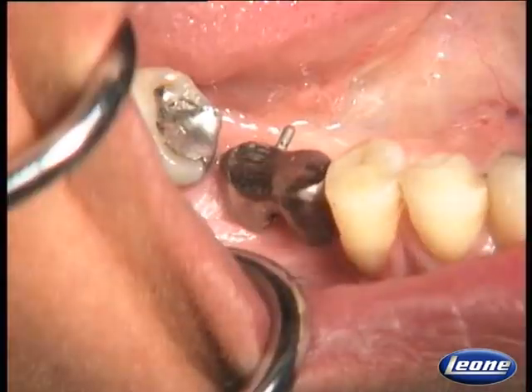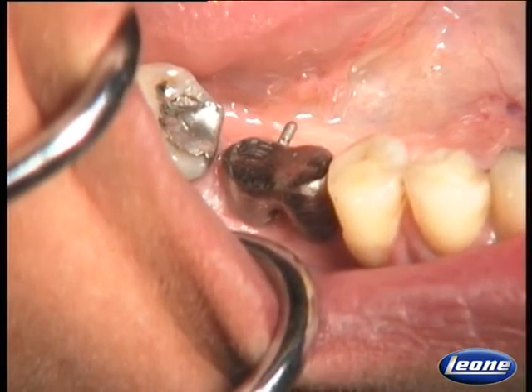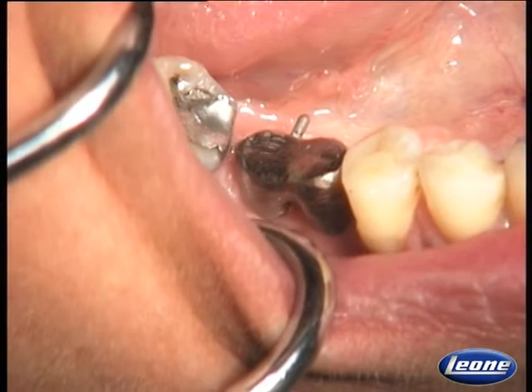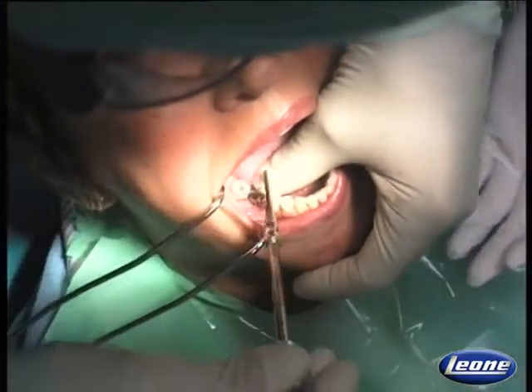Once the porcelain has been applied, the definitive restoration will be cemented with a temporary cement. I always use temp bond to cement. Doing so, if in the future the porcelain gets damaged, it can be easily removed and the bridge be repaired.